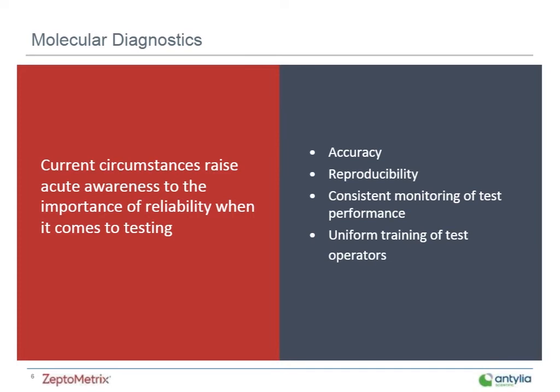I believe that no situation has really put this into a bigger spotlight than the current SARS-CoV-2 pandemic. And not only do we need accurate, quick, reliable diagnostic tests, but the labs performing the testing must have a way of monitoring the test performance so that they can catch any errors or any issues with, say, reagents or test operators and various processes that are going on in the labs.